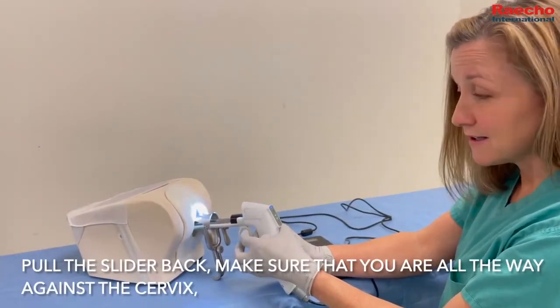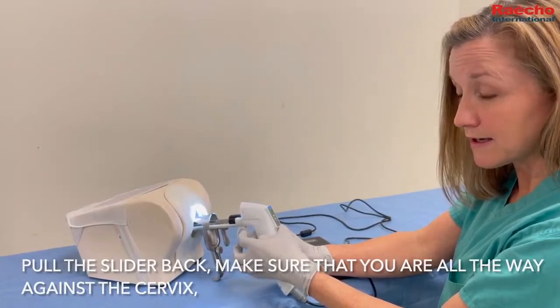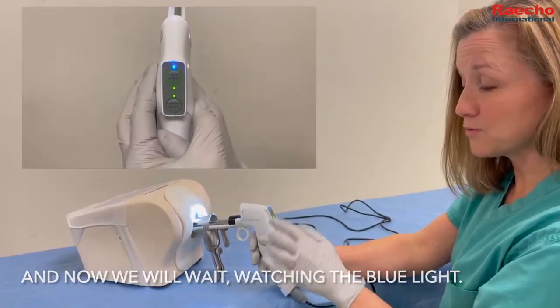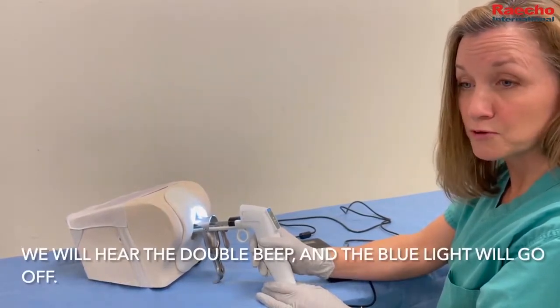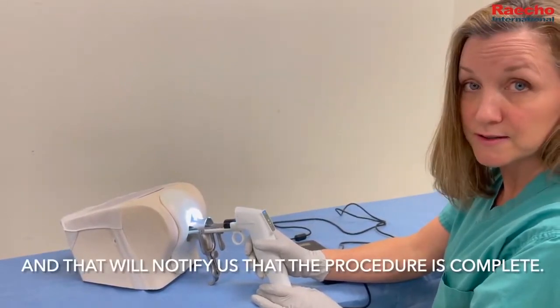Pull the slider back and make sure that you're all the way against the cervix. Now wait, watching the blue light. You will hear two beeps, and then the third time you'll hear a double beep and the blue light will go off — that will notify you that the procedure is complete.